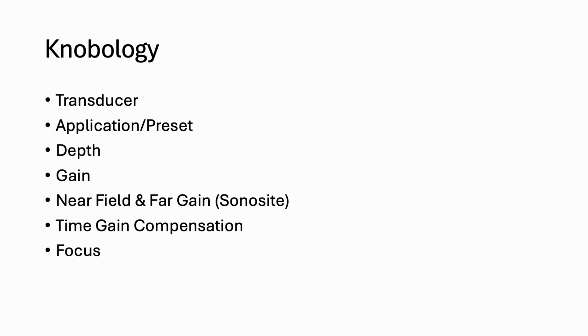The different knobology is often referred to as the transducer, the application or preset, depth, gain, near field and far gain, which is often seen on a Sonosite, time gain compensation, which is a little bit more in depth, but I'm going to go over it. You often won't use that, and then focus.